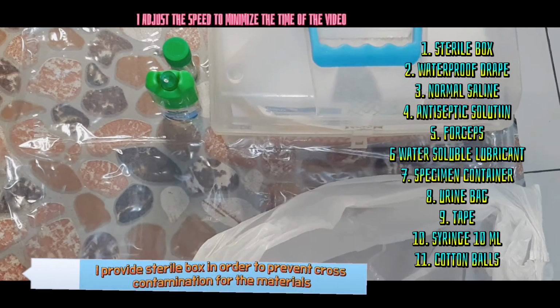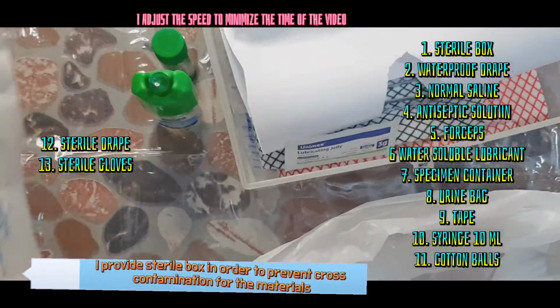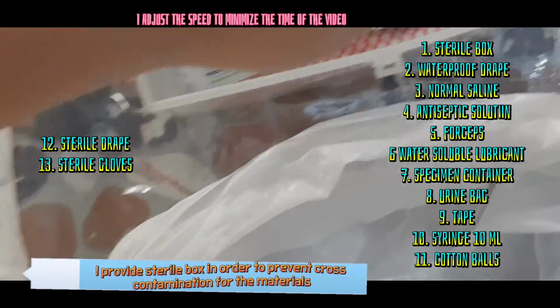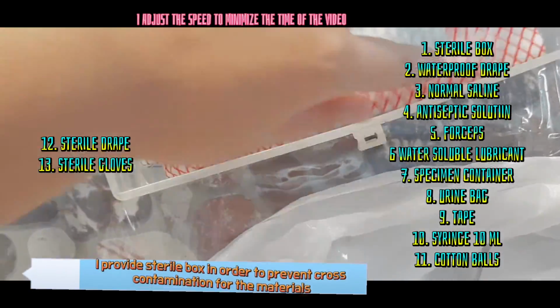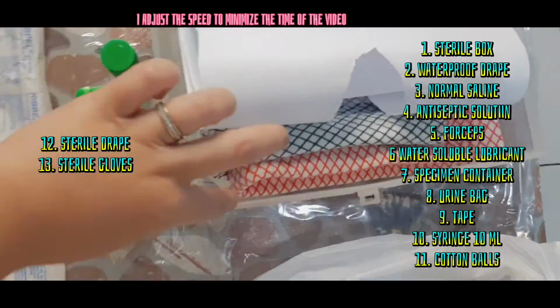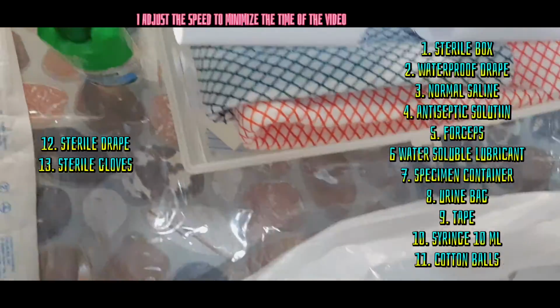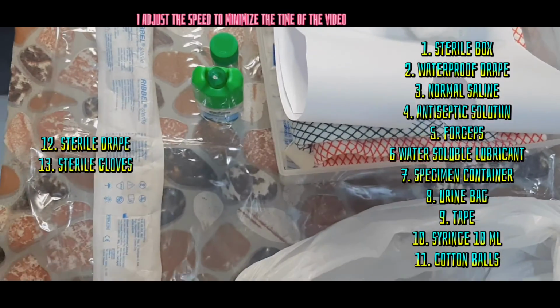So I will show you first the materials that I have here. In planning, you need to prepare all the materials and supplies needed for the procedure. The first thing you need is a sterile catheter of appropriate size, which is size 14, and then the waterproof pad, the sterile gloves, the urinary bag, the antiseptic solution, the cotton balls, the water-soluble lubricant, the tape, and the specimen container. Then the sterile fenestrated drape, the 10 ml syringe, and also the towel and soap and water.